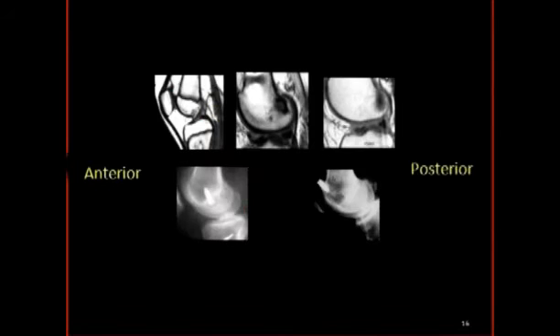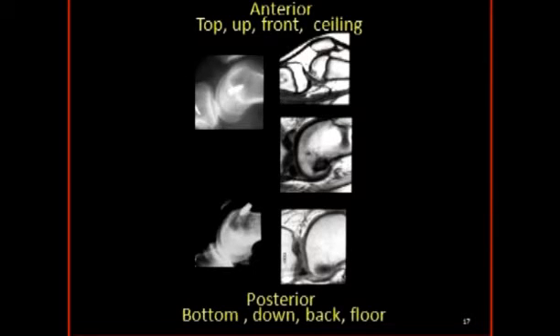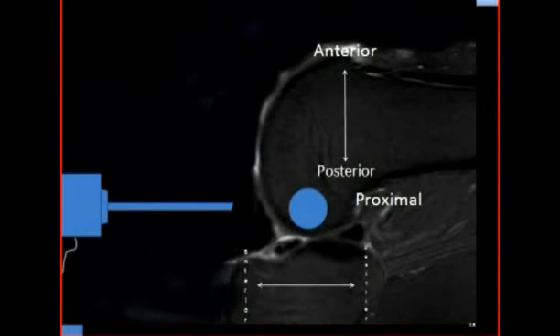With a lateral view in the anatomic position, the locations of the anterior and posterior parts of the knee are apparent. But when the limb is horizontal, as during surgery, it is easy to forget that the anterior part of the knee is towards the ceiling, and the posterior part is toward the floor. So that, when advancing a scope horizontally into the knee, it is traveling in a posterior direction only with respect to the flexed tibia. It is traveling proximally with respect to the femur. In order to go to the posterior part of the femur, the scope must incline downward toward the floor.